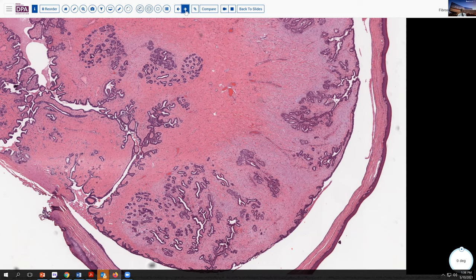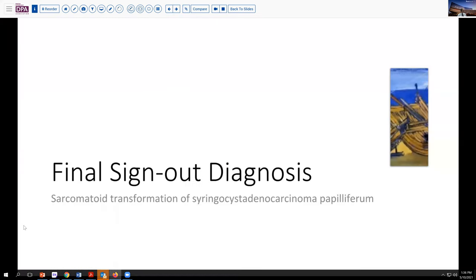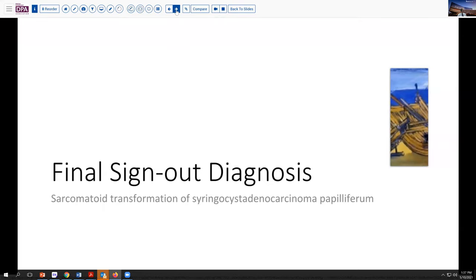So to conclude today's discussion, our final sign-out diagnosis is sarcomatoid transformation of syringocystadenocarcinoma papilliferum — a highly unique case, but illustrating our approach to zebras and unicorns and common and uncommon locations and presentations that are all thoughts worth thinking about as you encounter the challenging cases in your practice.